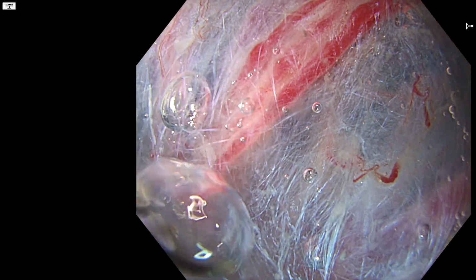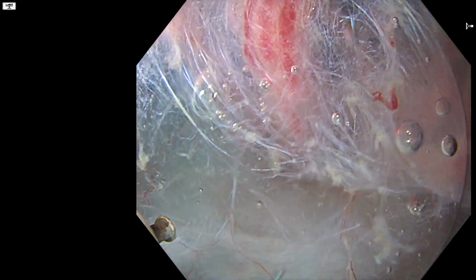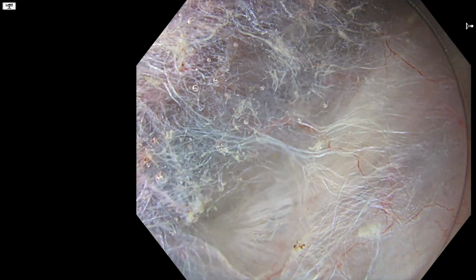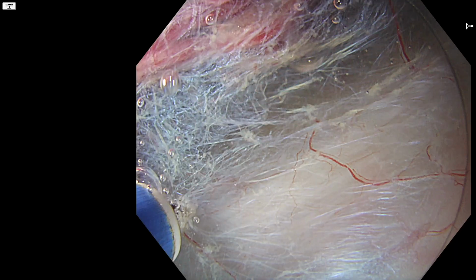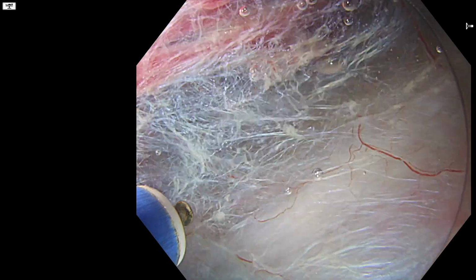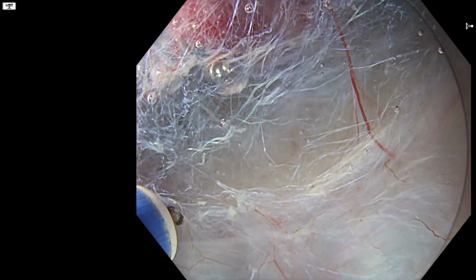But as you see, I mean, it's mainly the views, isn't it? Because if you look at the submucosa, it's just nice and expanded, almost transparent, and you can clearly see the vessels. So for me, these advantages are really unparalleled, and it actually couples quite well with pocket creation method, because the pocket helps keep the fluid contained. So all in all, when I can use this technique, I usually will.